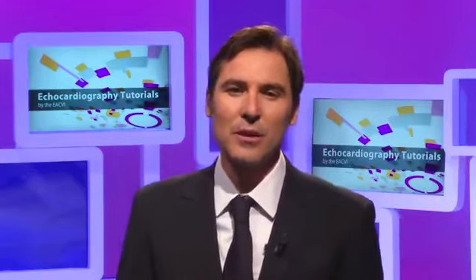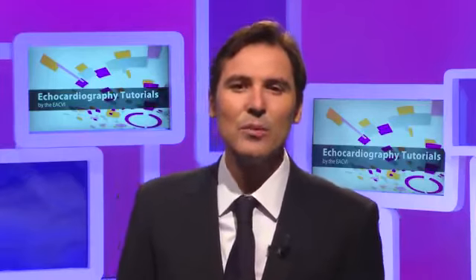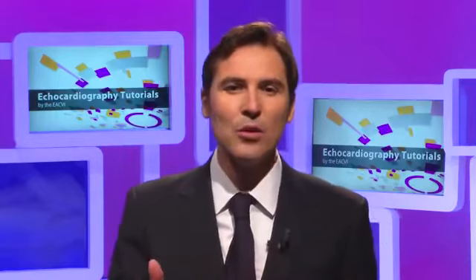More and more patients are referred for the assessment of valve prosthesis, and Christine Ari will present how to evaluate mechanical valve in aortic and mitral positions in 2 different patients. She will start addressing the different echocardiographic parameters that need to be evaluated for differentiating normal from abnormal functioning of prosthesis. And she will end up these presentations by 3 different pathological cases.